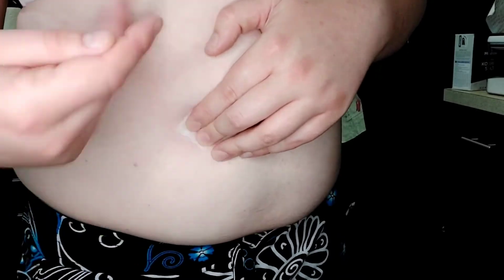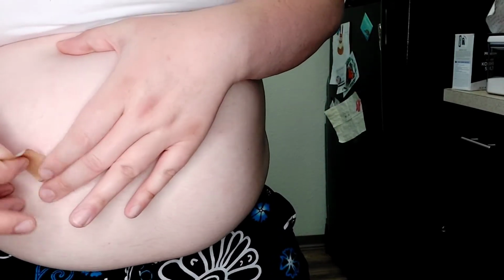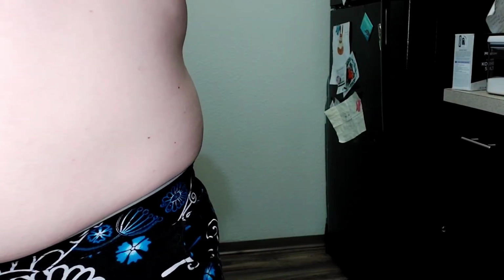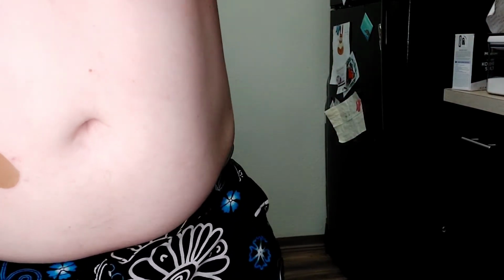I will change out the needle though, because after you use a needle once, especially these fine ones, you will find that the needle itself bends in small ways that you can't quite see, but they are there, and they will make it more difficult to finish the injection later. This is what I get for trying to record myself doing this when I'm still a little bit new at doing it myself, so hubris.